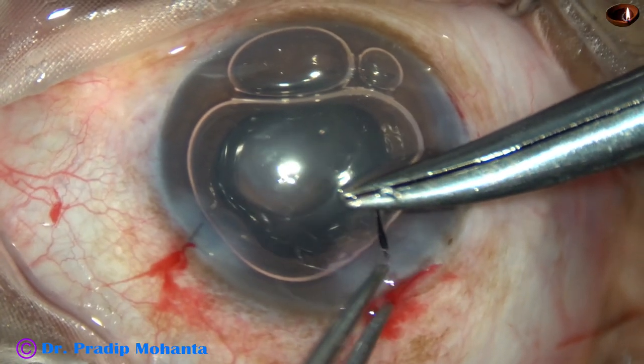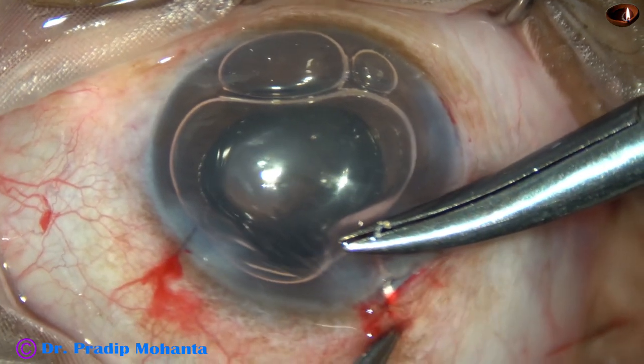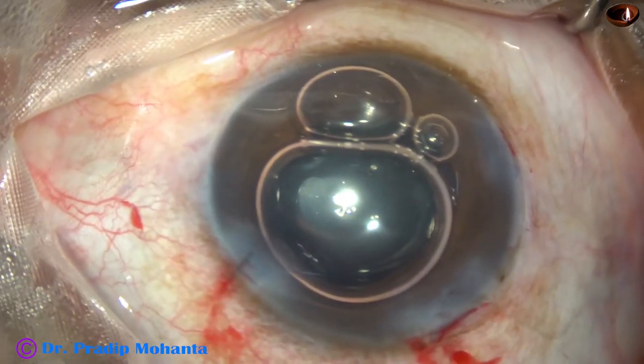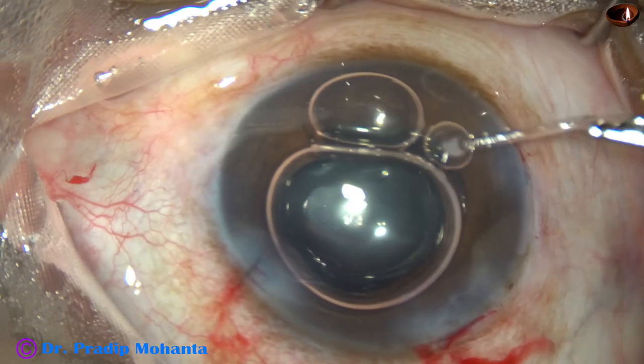I put another suture at the main wound at around 11 o'clock, but before tying the knot I have to do some more work.